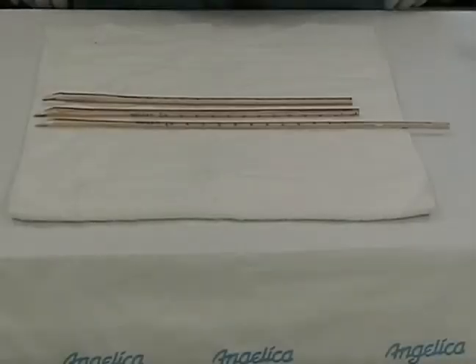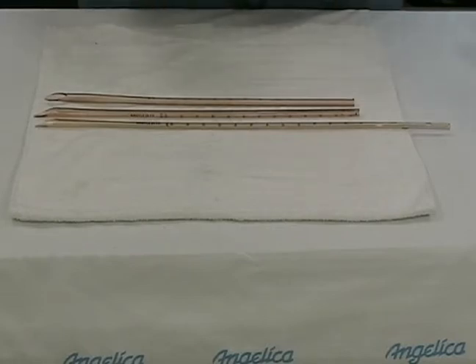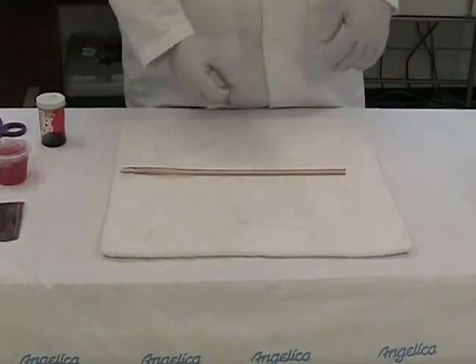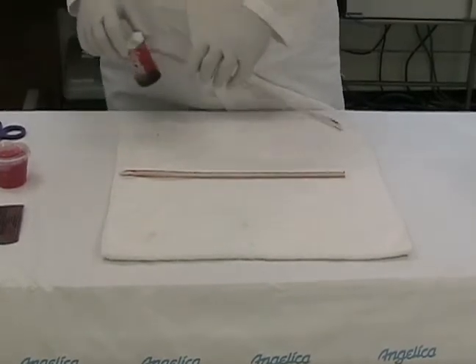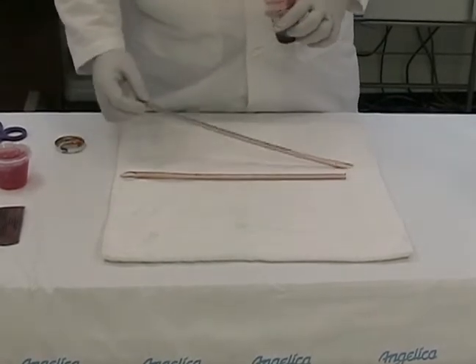Begin with a 28 French chest tube. Cut it below the fenestrations to prevent any leakage when you run blood through the tube. These tubes have a coating on the inside which prevents coagulation, so you'll need to repeat this process 3 or 4 times. This process being pouring the blood in, allowing it to dry for a day, and then coming back the next day and pouring more blood in.